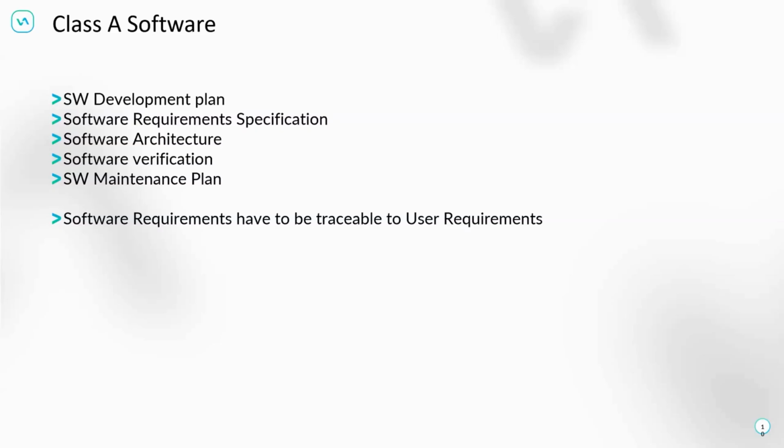You can utilize tools like Doxygen. You can utilize any kind of easy setup and tool set. So it is a very straight and quite simple way forward to help yourself, and the outcome will be that at a later stage these particular metrics will help you to maintain your code on a long-term basis.